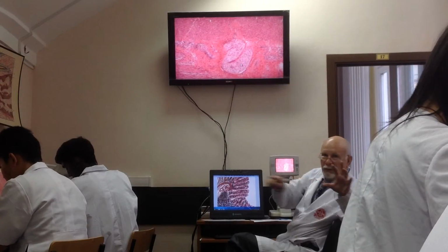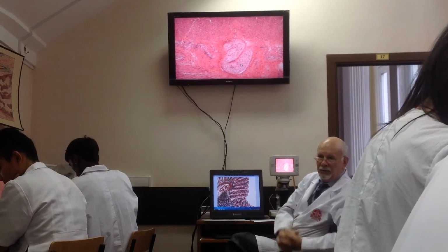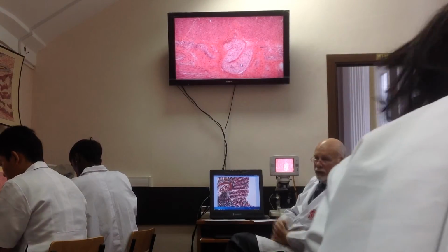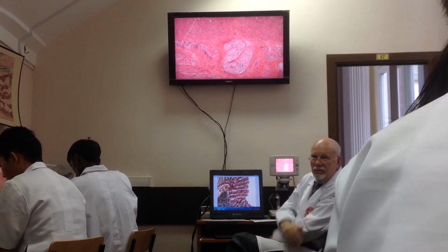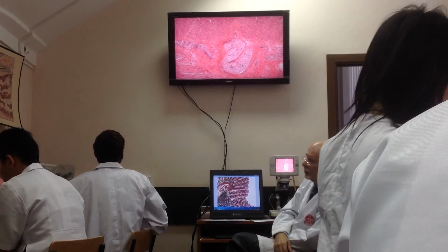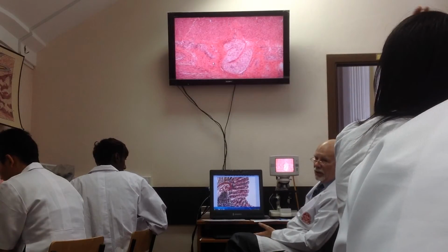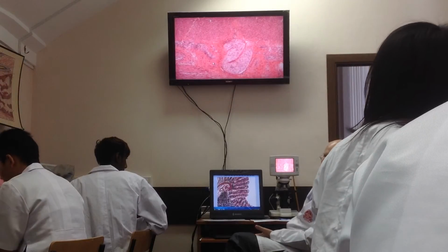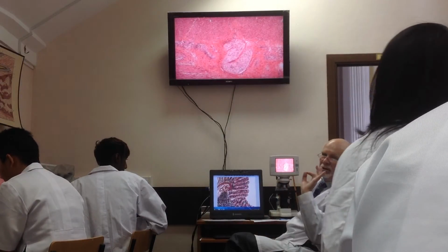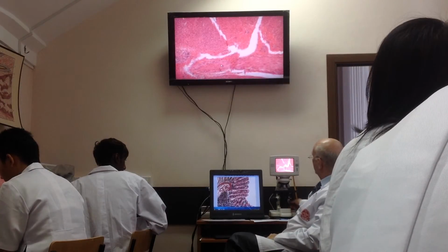But processes of cell bodies form the peripheral nerves. It's a part of a peripheral nerve that goes along the intestinal wall. See it? It's nervous tissue. Compare the coloration with connective tissue. Connective is more reddish. Here less colored, slightly pink. It's a peripheral nerve.